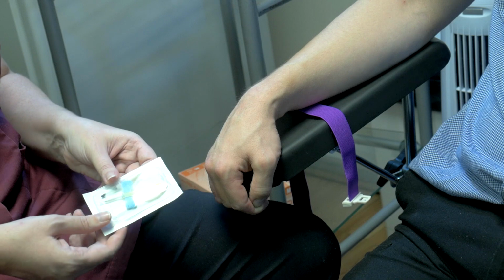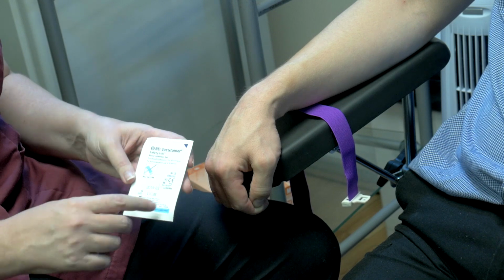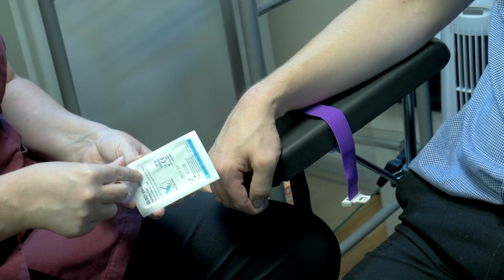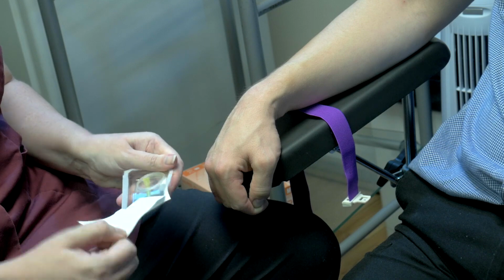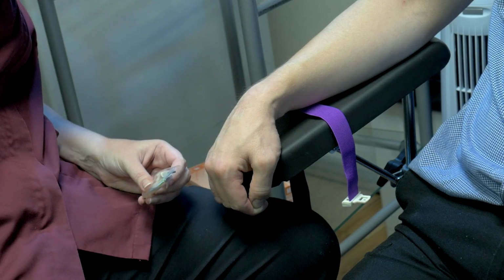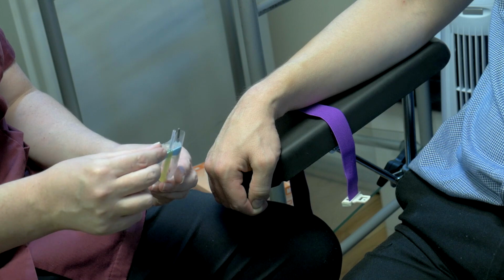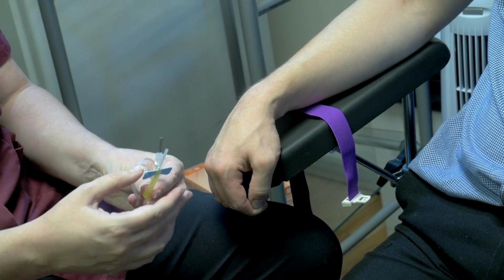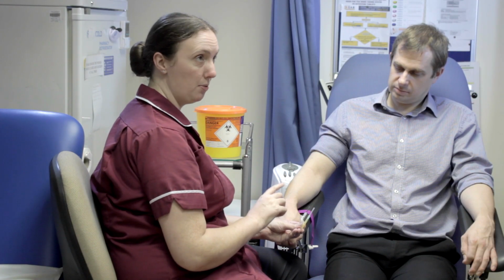On the back of our winged infusion set, otherwise known as a butterfly needle, we have a little blue arrow, and this is where we open it from. So we just peel the paper back to make it nice and easy to pull out. Then you'll have a little bit of plastic which we pull over the top of these 2 needles and discard. Now we need to remember which of these 2 needles is the more dangerous one.